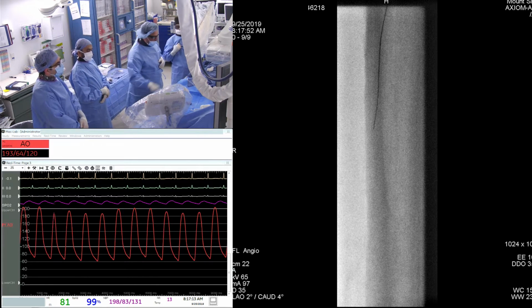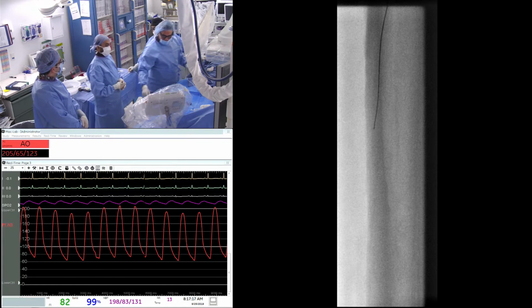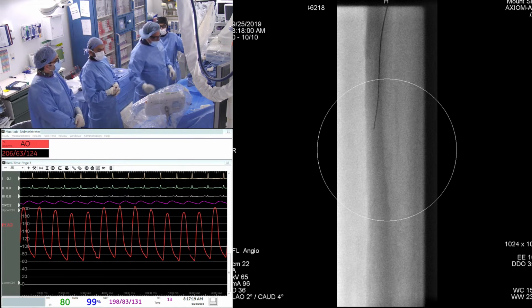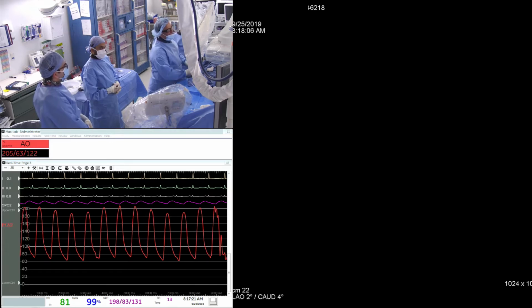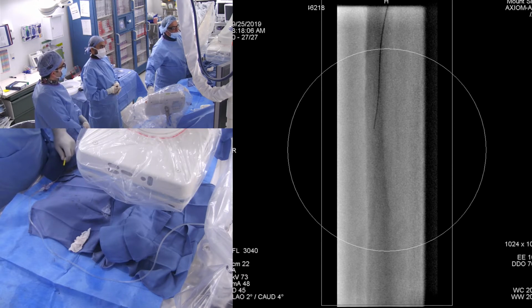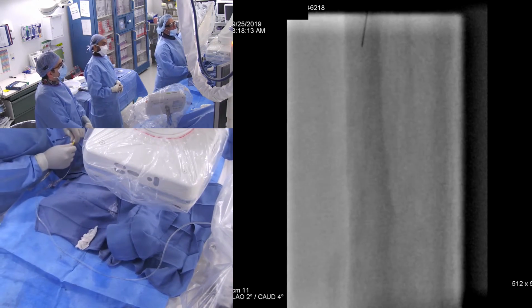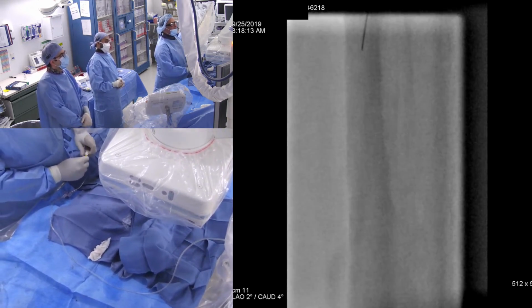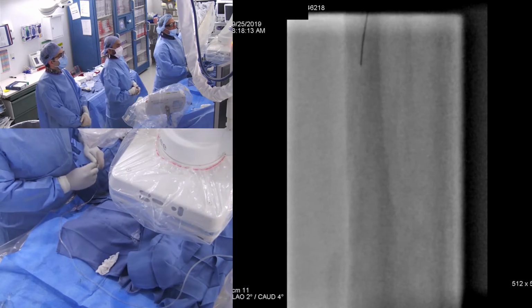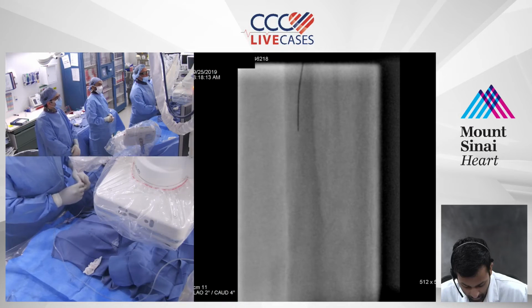So, Ajit, one question for you. I know that obviously you can cut down, you can do whatever you need to do. A lot of the cardiologists are using pedal access very liberally. We've been advocates of not doing pedal first, and for instance in this case we didn't go pedal, where I think a lot of people would have. So my question is, what is your algorithm to do pedal, and when do you do pedal, when don't you do pedal?